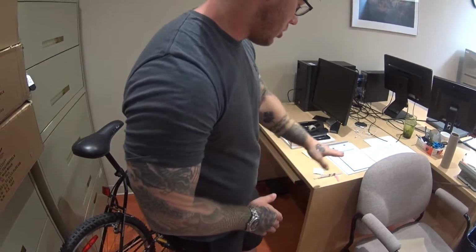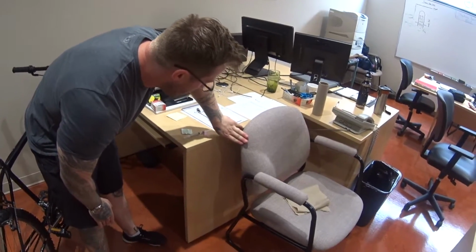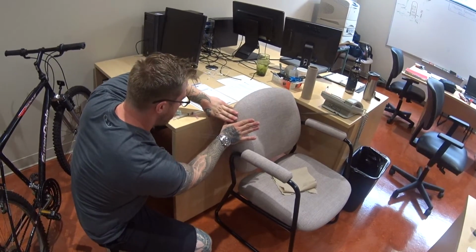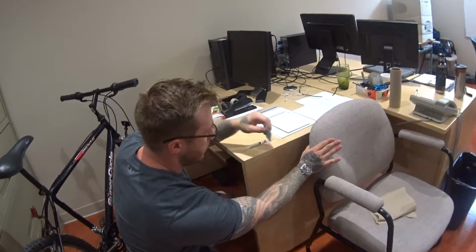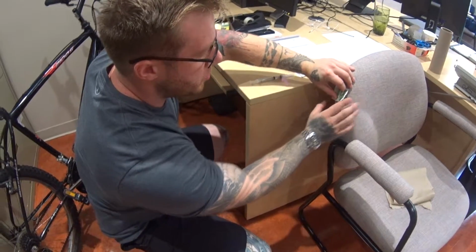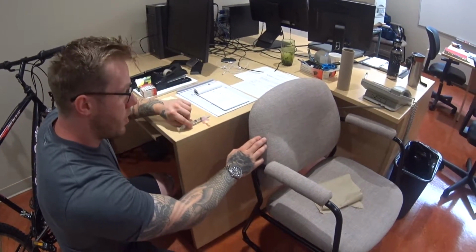Perfect. So I'll use this chair as the mannequin. I'm going to find Mr. Milton's acromion process, 3 fingers down, and I'll make a small V here. I'll use my alcohol swab and clean the area. I'll get Mr. Milton to hold that if he's capable, and Mr. Milton is capable, so he'll hold that while I get my needle ready.